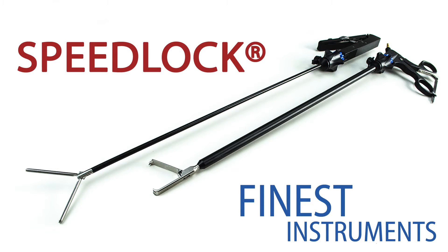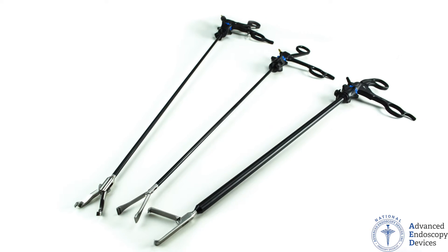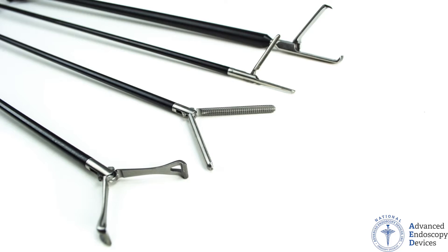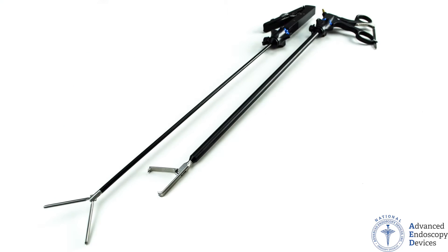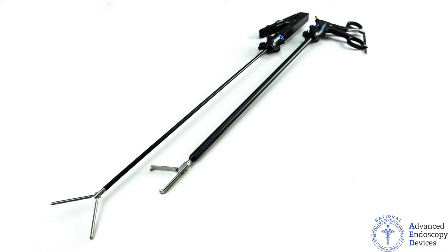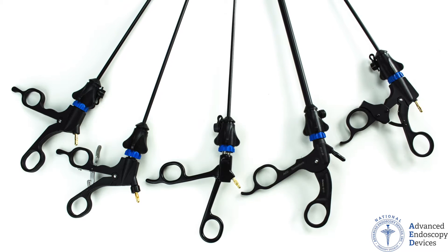Welcome to Advanced Endoscopy Devices, where we offer you the highest quality endoscopy equipment at factory direct prices. AED's 3rd generation SpeedLock modular forceps are the industry's premier laparoscopy forceps. Its quality and handling surpasses any other product line in the endoscopic market today.